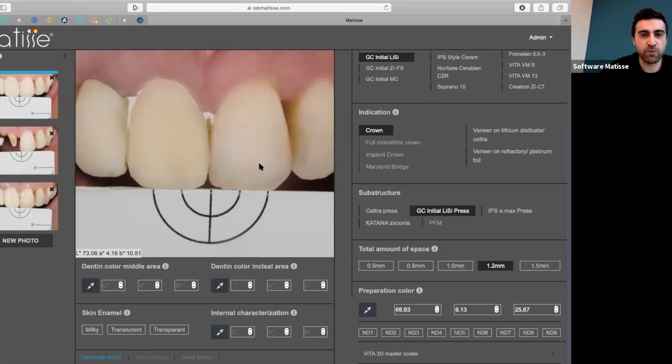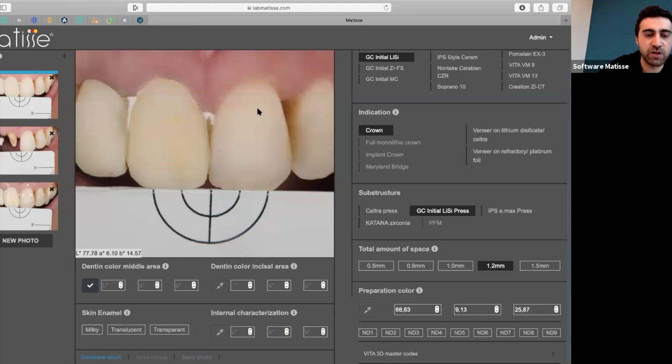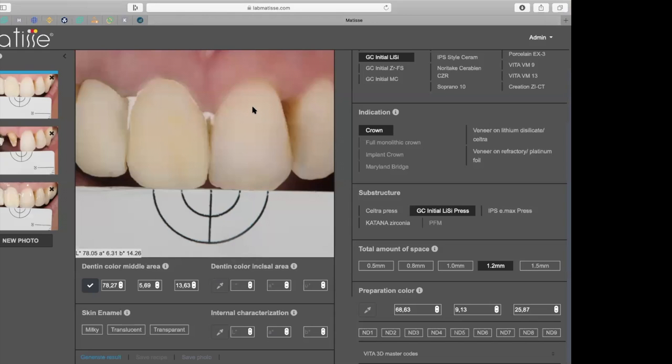So the first one, I will get a recipe to replicate this whole zone. So where to measure? One third from the cervical. When you are in this area and you look at the digital color meter, you have to find the highest L number, but also the highest A and B number.